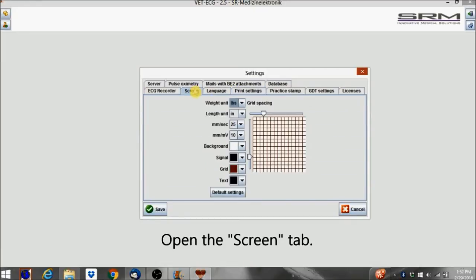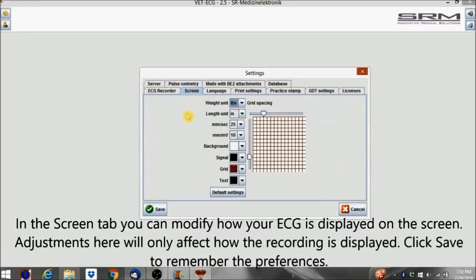Open the Screen tab. In the Screen tab, you can modify how your ECG is displayed on the screen. Adjustments here will only affect how the recording is displayed. Click Save to remember the preferences.